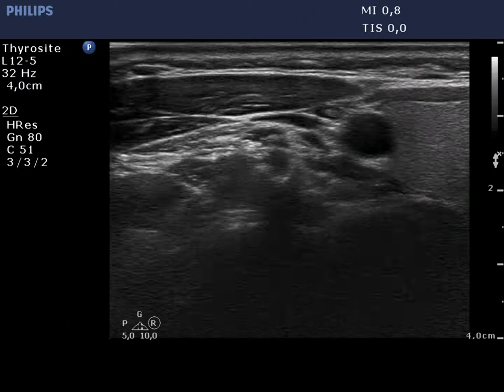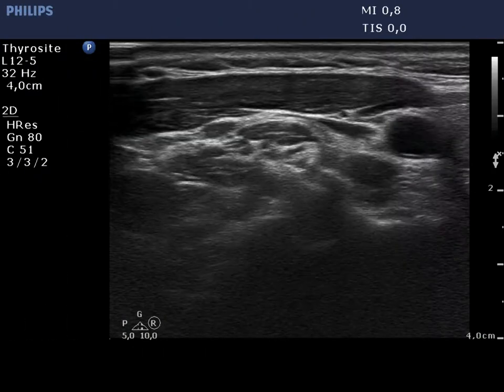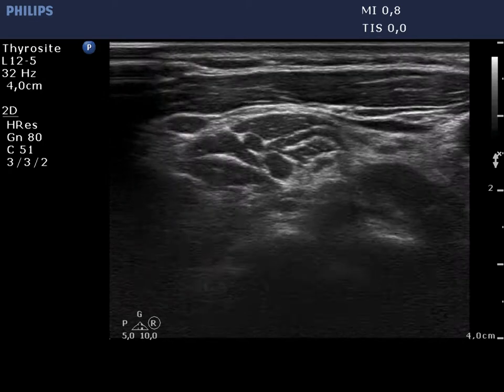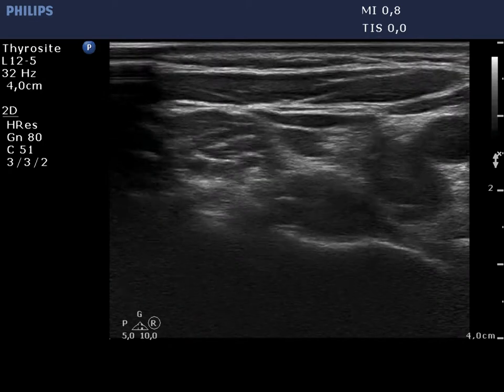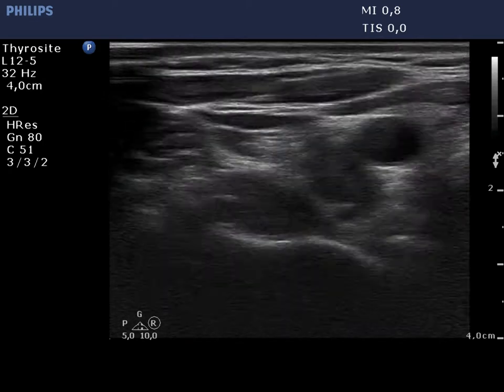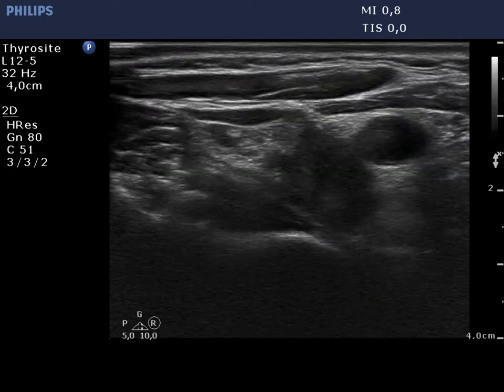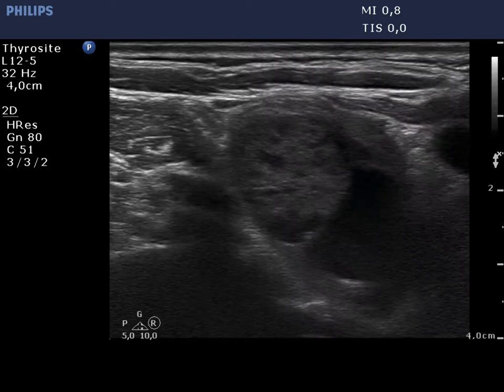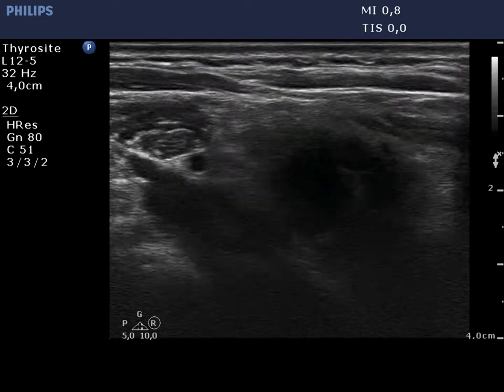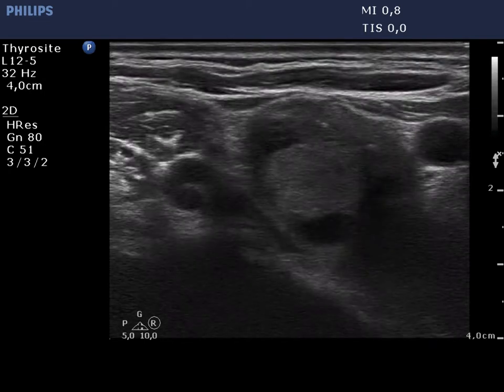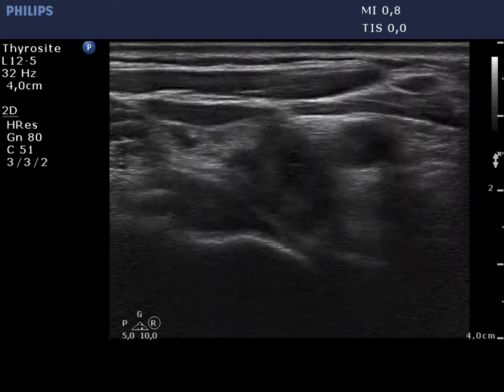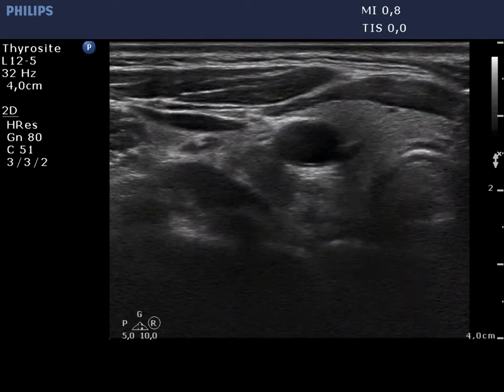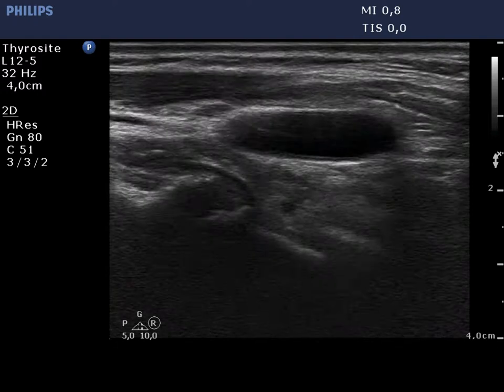The normal thyroid and the carotid artery are demonstrated. We move downwards with the transducer and find a mixed, solid cystic mass lateral to the right lobe.